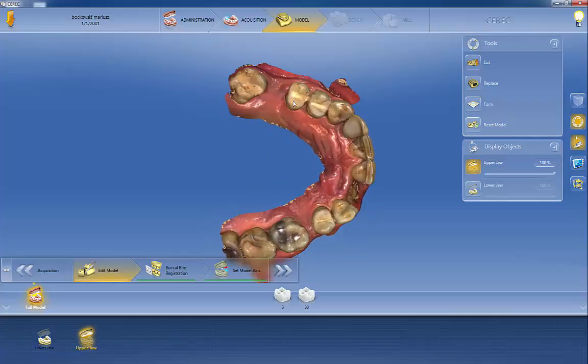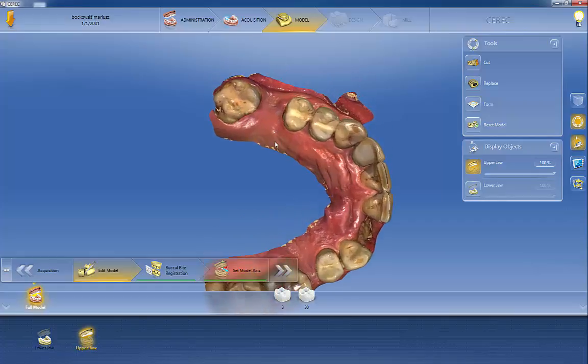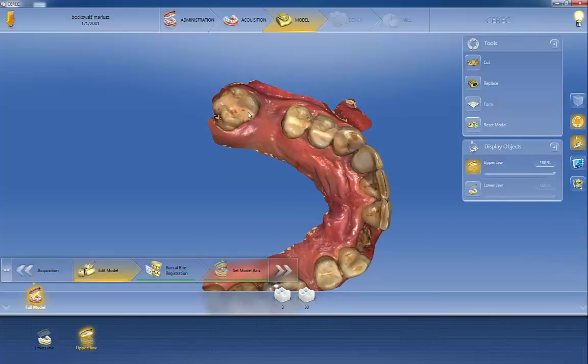As you can see right here, it is rotated, and from the CBCT, the significant bone loss here. And so what I would like to do is actually go ahead and put a normal size tooth number 3 in here. And to do that, number 2 is in my way, so I'd like to go ahead and remove, virtually extract tooth number 2.